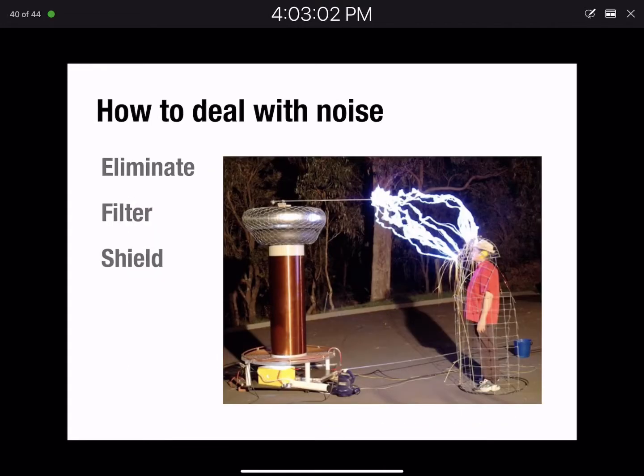So beyond just controlling your environment, trying to keep things away from people, another approach is to use what's called a Faraday cage, which is basically some sort of cage or a box, like what you see here on the right, that's conductive and connected to an electrical ground, so literally into the earth.